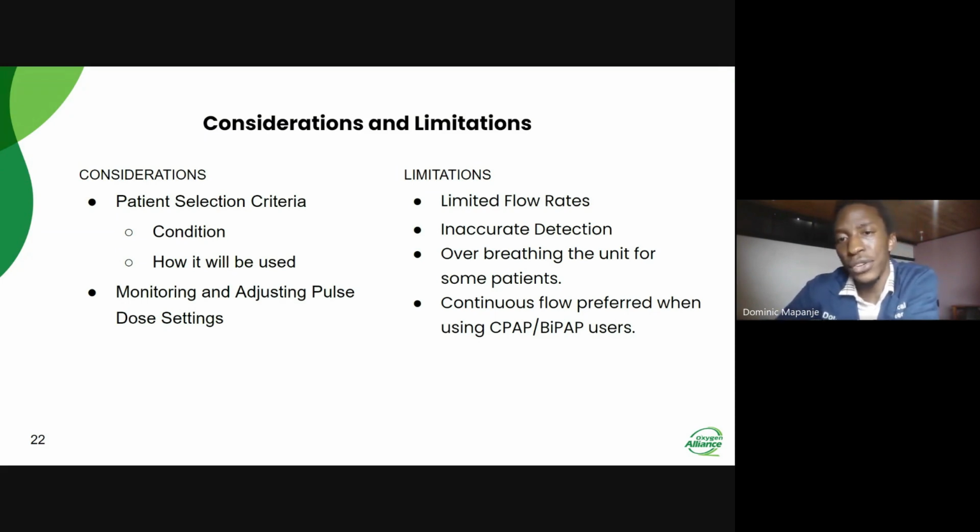There are some limitations that come with these devices. We have said that they are portable, efficient, and lightweight, but they also have limited flow rates. These are smaller devices, so they have limited flow rates. For higher flow rates, the doctor recommends that you use a continuous flow of oxygen delivery.